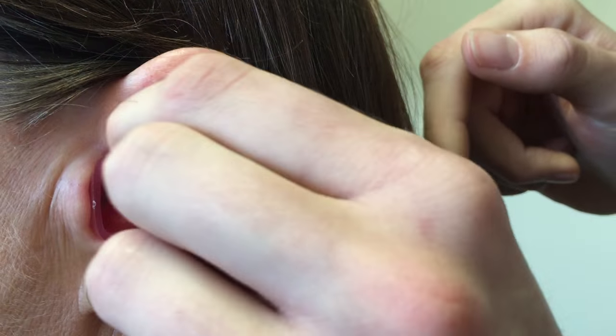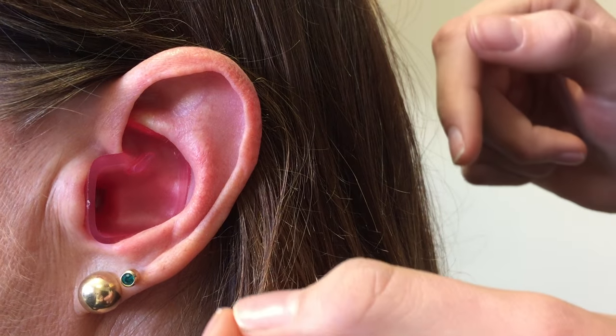There's a tab on the earplug. If you give that a bit of a tug and feel a bit of resistance, we know we've got a good fit.